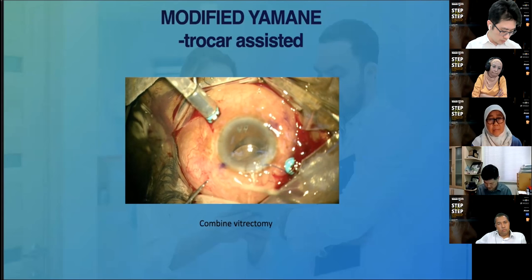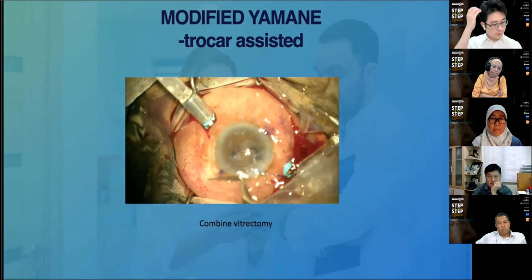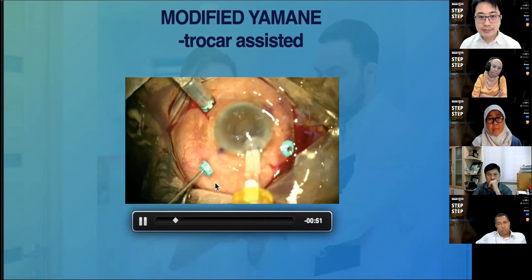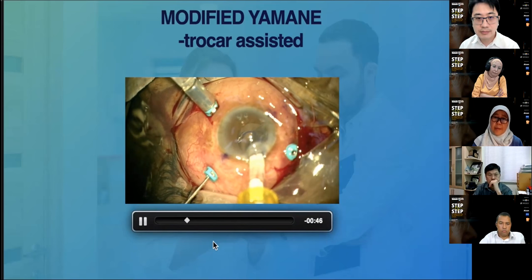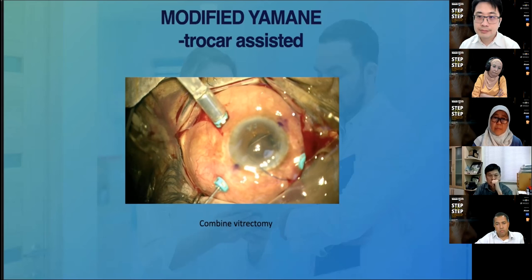Slowly retract the trocar while keeping the forceps inside the eye. Once the trocar is off, we slowly externalize the haptic and cauterize it. The beauty of this technique is it is very simple, with good control of the procedure, but of course, I have to create another wound for the trailing haptic. Another beauty of this procedure is we don't have to dissect the conjunctiva, so no cutting is needed, and we can still use it as a transscleral fixation of IOL without the need to cut down the conjunctiva.